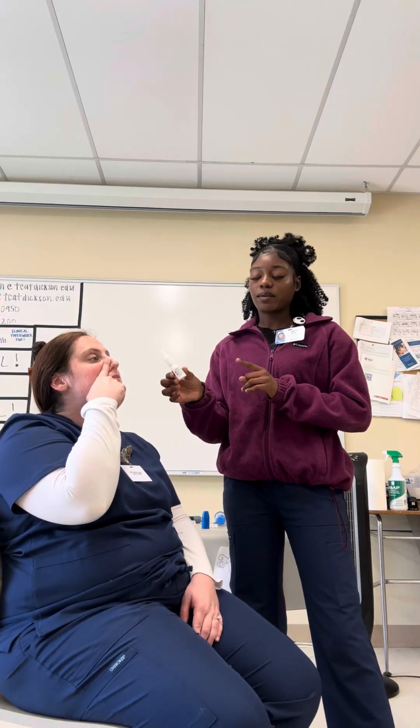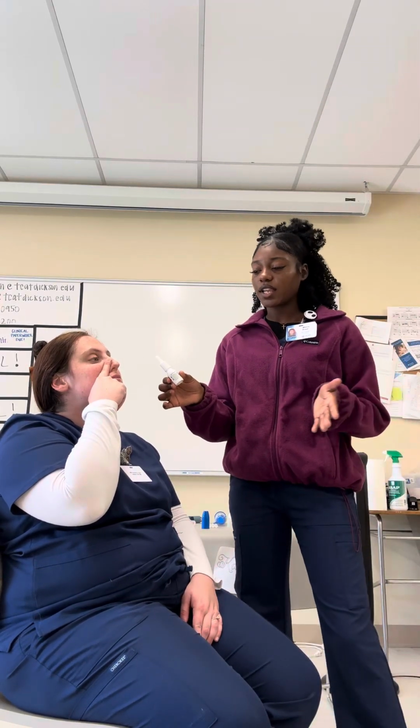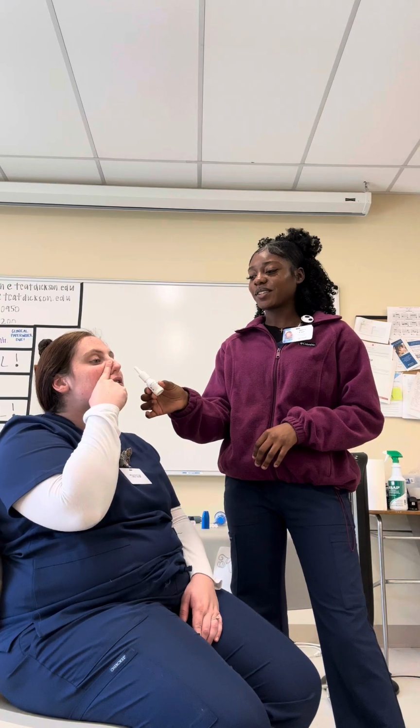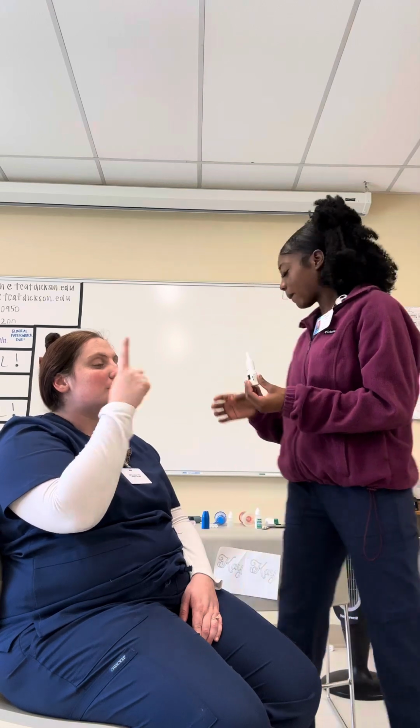And while you are administering the sprays, however many that is ordered, you're gonna have your patient breathe out through their mouth. So, breathe out through your mouth. Okay. And then after you finish administering the sprays, you're gonna clean this off with alcohol or anything like that. Top it back on. If you first open this, you would date it, whatever the case may be. And then you're gonna perform hand hygiene, make sure your patient is okay, they don't need anything, and you're gonna document that it went well or if it didn't go well. And that is it for nasal sprays.